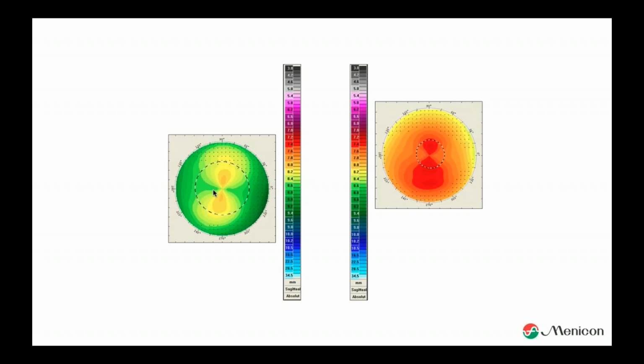What we see over here is the same eye as before, but now it's more green and it's more red over here. What is the absolute scaling doing? Well, the absolute scaling is telling you, okay, these are the order of colors I can show you. I have no more to show. These are all the colors. But besides the fact that these are the colors, these are the maximum values I can measure. So 3.8 is the steepest part I can measure. I cannot go steeper, and 34.5 is the flattest part I can measure. And what you see happening now is that the image is adjusting itself to the scaling.